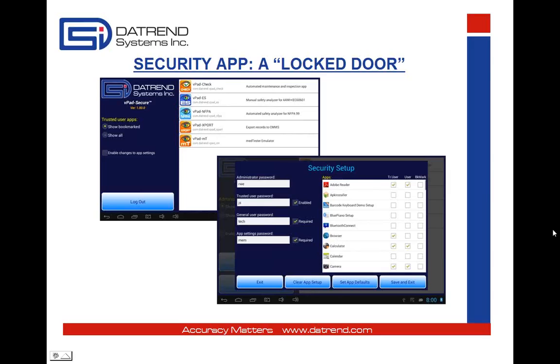Securely stored maintenance records are encrypted with a private key before delivery to the maintenance supervisor or the customer, so that records cannot be tampered with while they're in transit.